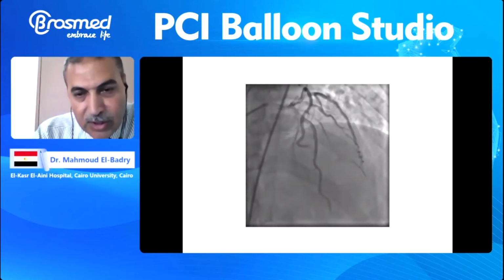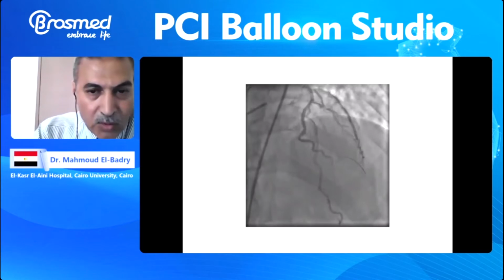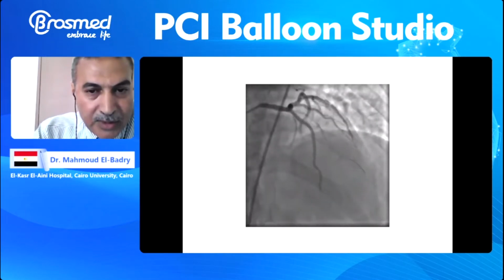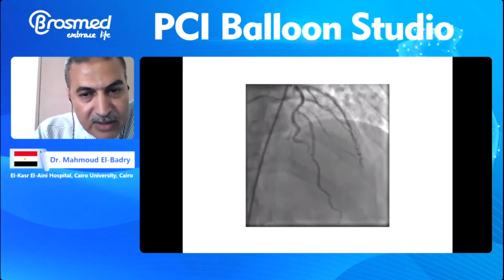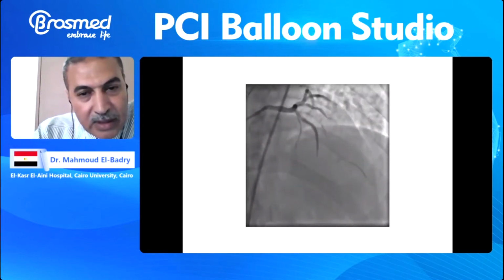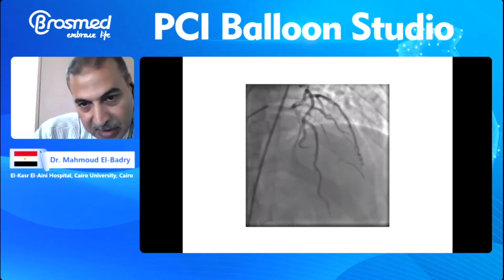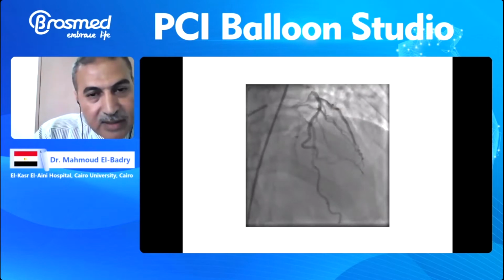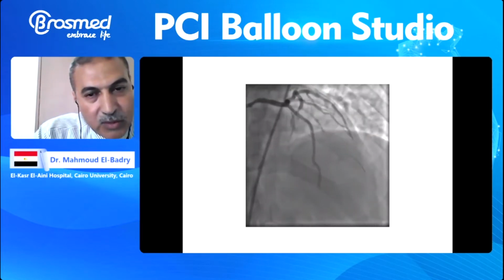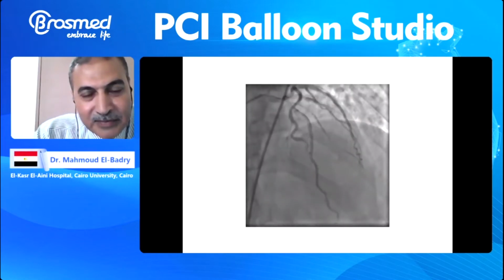So the decision now is whether to do a drug balloon or to put a stent in this long disease segment. We don't have drug balloon available all the time, and because of the expenses, sometimes we use the stent, which is cheaper than the drug balloon. Sometimes.